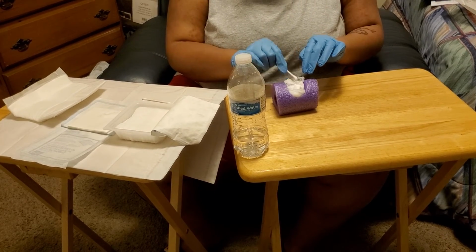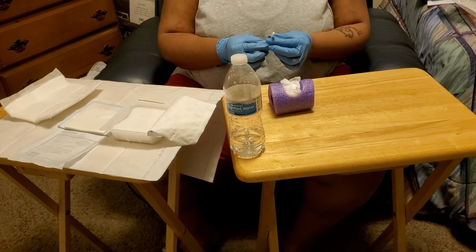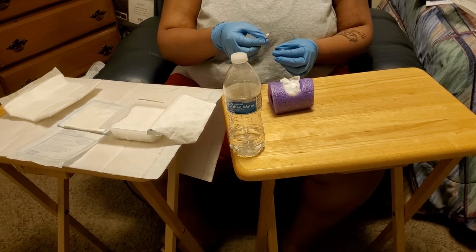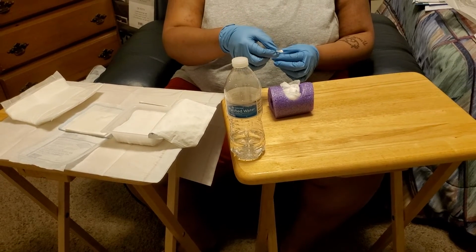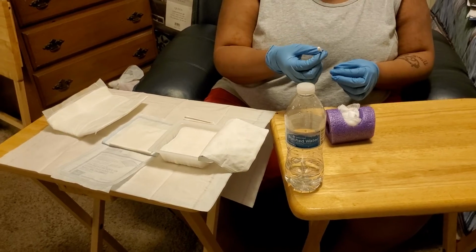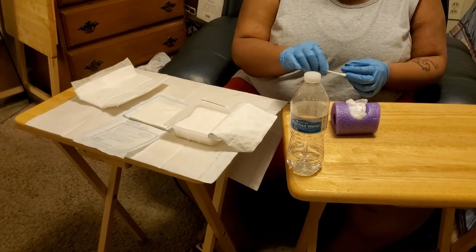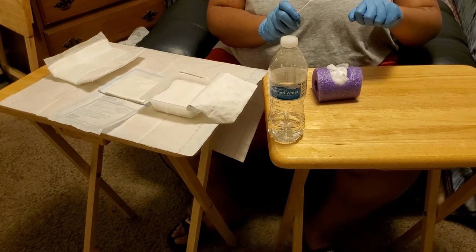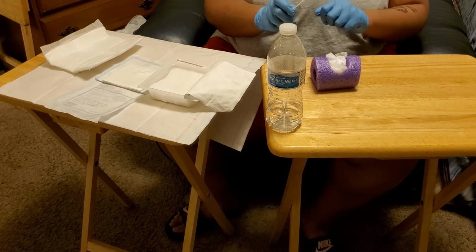Right? And so another thing that I forgot to do was to measure the length and width of the wound with the Q-tip, as well as assessing the area to make sure that everything's okay. Also making sure that we squeeze out the gauze so that it's not too wet.